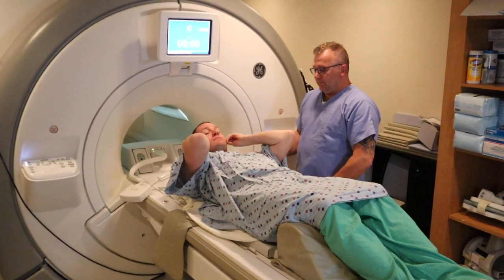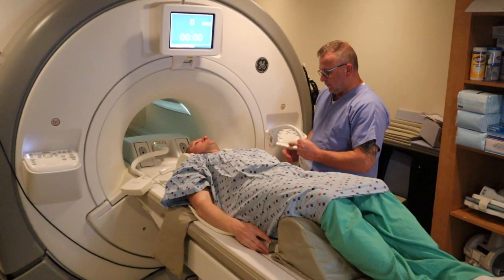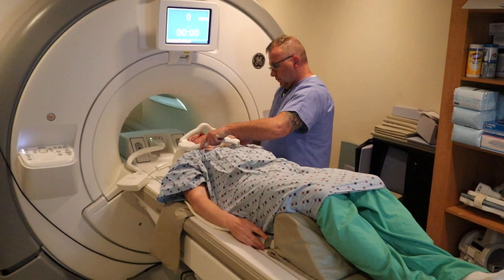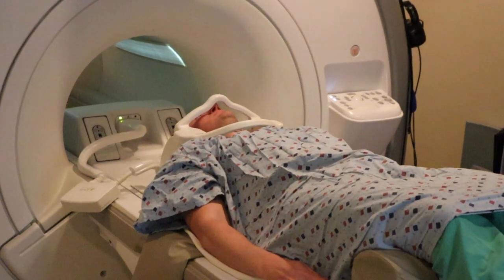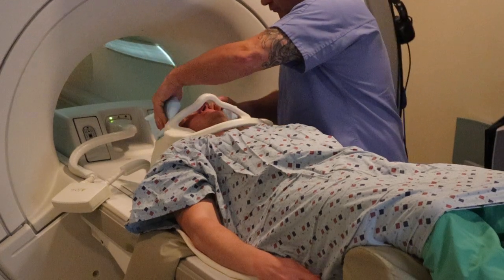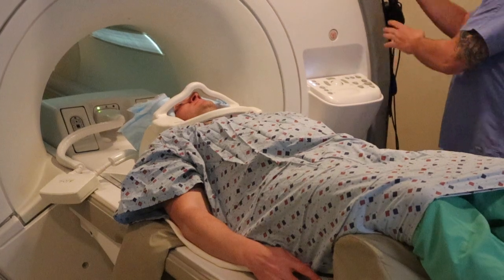We're now going to position for a thoracic spine MRI. It's going to be very similar to the C-spine and the headfirst lumbar spine study. You do want to fasten that anterior piece, as that's going to provide optimal signal for the coil. This allows us to count specifically from the top to the bottom, so you want to attach that.